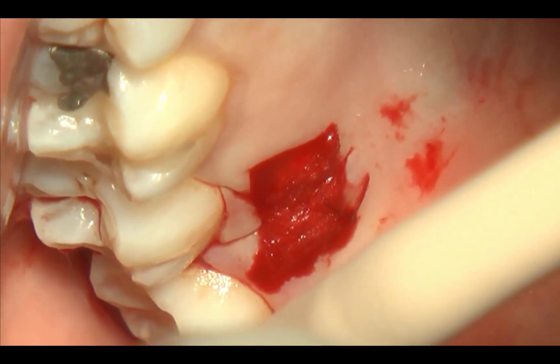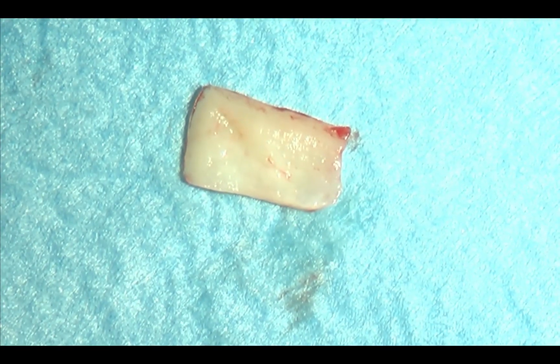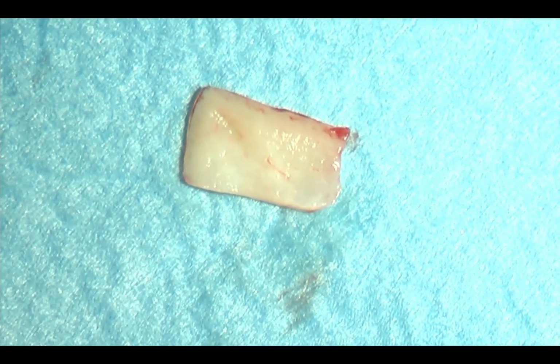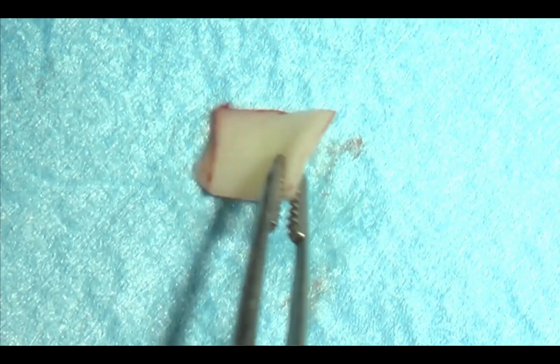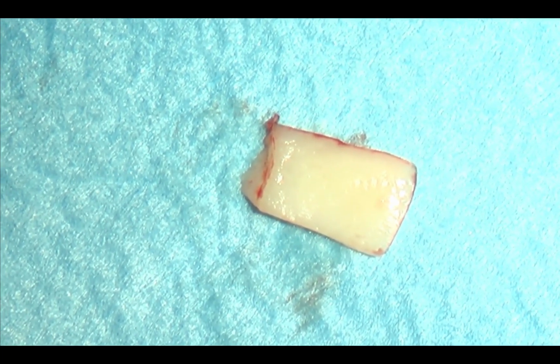The patient can rest. This is the inner aspect of the graft. You see it's completely white. There is no need to remove any fatty and glandular tissue, so we can immediately go back to the desepithelialization.